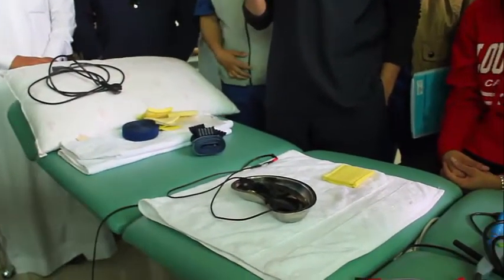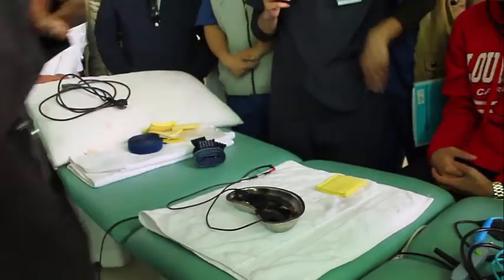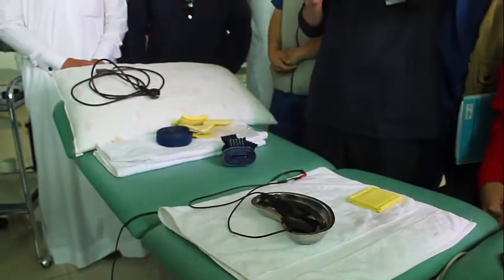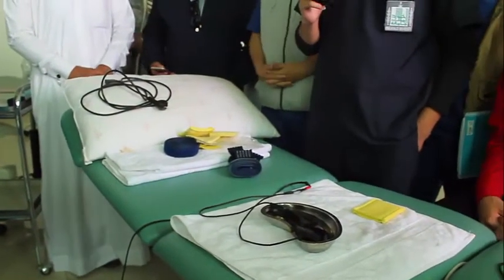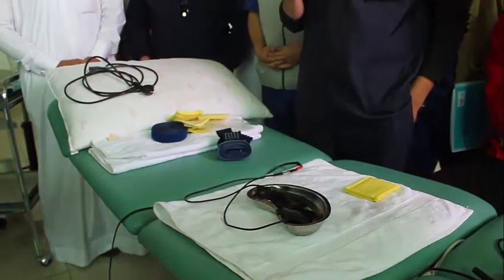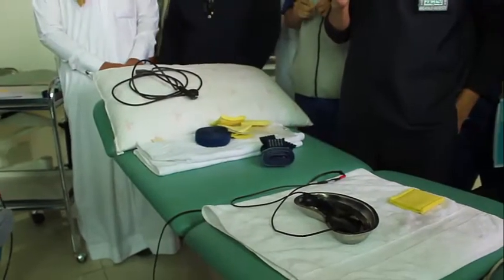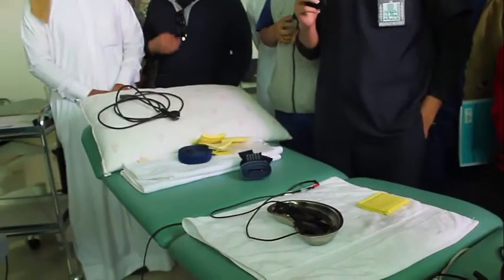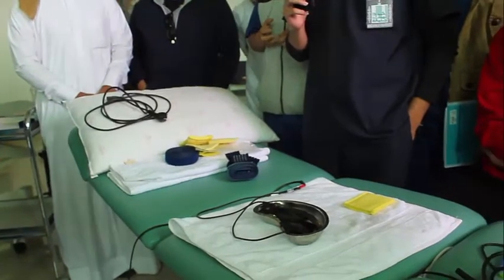That's why when you stimulate the nerve, the cathode should be the active electrode, which should be kept on the nerve or muscle. The opposite one, the ineffective or adjacent electrode, the anode, will be in another place during the stimulation. First cathode. Cathode for stimulation of the nerve or muscle. Good. Okay? So this is why you should know which is cathode, which is anode.